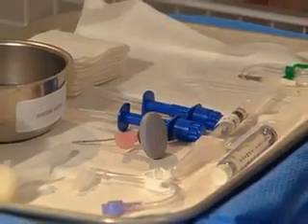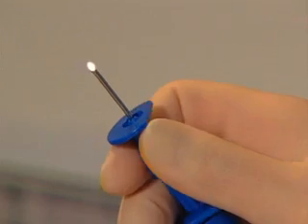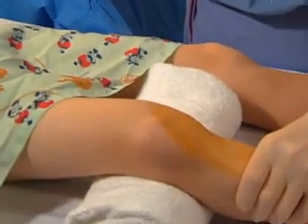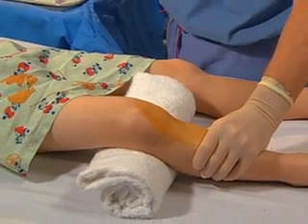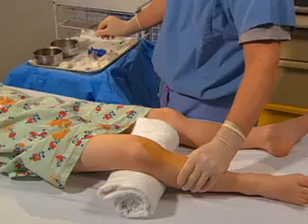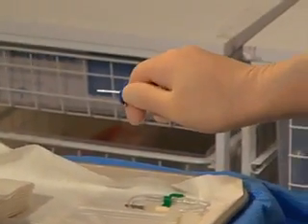When using manual insertion, remove the safety cap from the needle. Ensure that the stylet is appropriately placed within the needle and that the bevels are aligned. Using your non-dominant hand, stabilize the limb distal to the insertion site. This allows for counterpressure against the advancing needle and prevents unexpected patient movement. Make sure that no portion of your hand is behind the insertion site to decrease the risk of needle stick injury. Place the needle handle in the palm of your dominant hand.